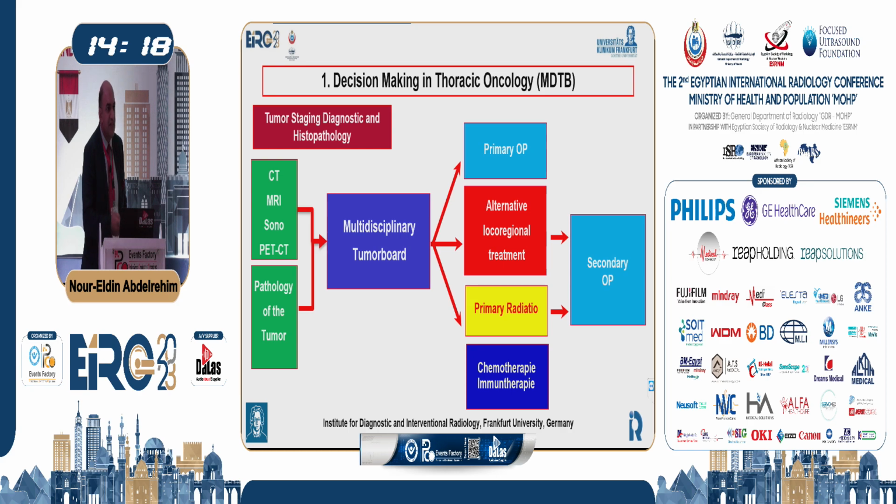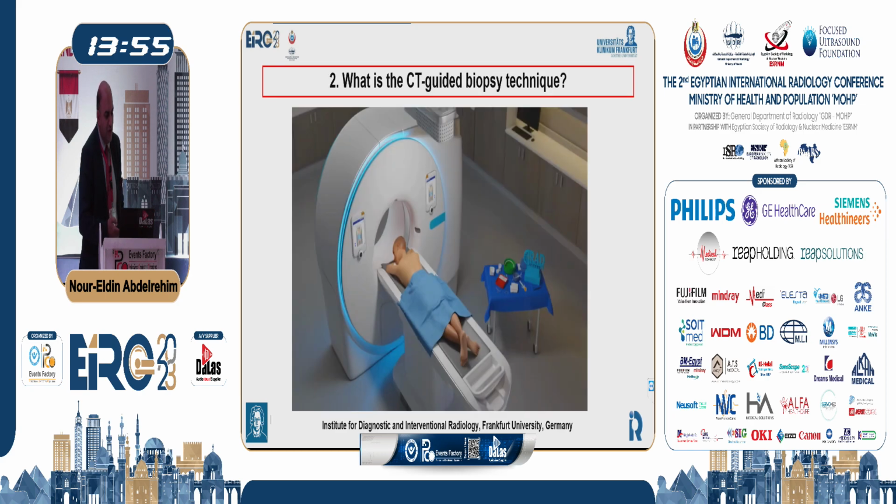This is the most important reason to gain the histopathology, as the histopathology will also show us the molecular analysis, in which there may be a resistance of the tumor towards chemotherapy. So we also need an adequate biopsy core in order to provide proper management of the patient. So how is the CT-guided technique done?